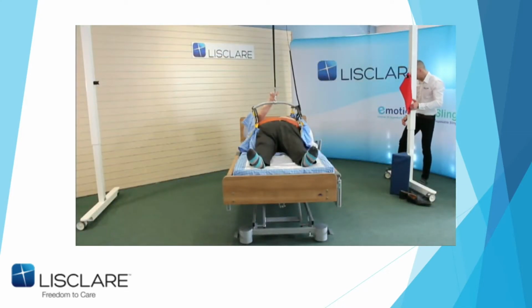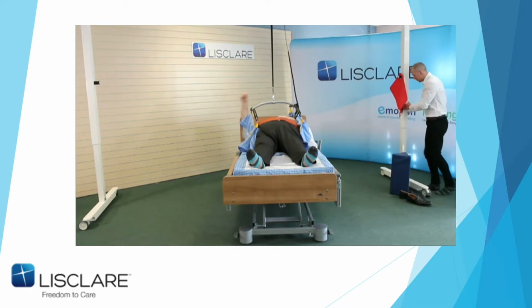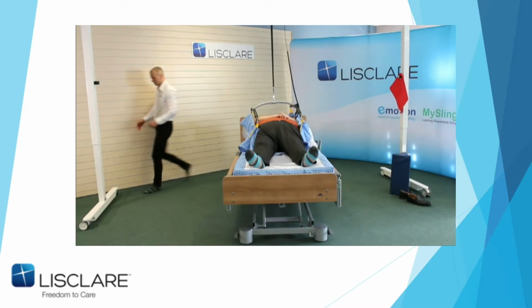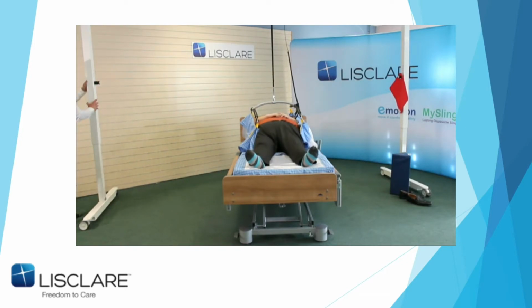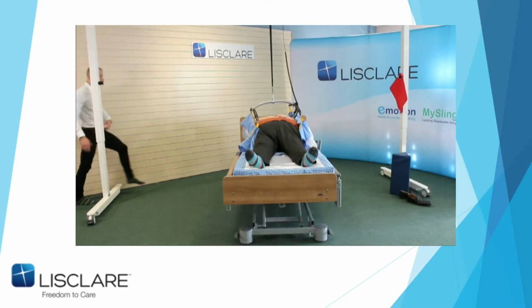Keep going, John, until you look at the angle. That's you. And then he's going to put the brake on that side and move the gantry up on that side. Now you could, obviously, if the gantry is a fixed hoist, move the bed once you've lifted me, okay? To give you my size and weight, I'm 6'1" and about 27.5 stone. I've lost half a stone, so I'm quite proud of that. I've actually lost more, but that's another story.